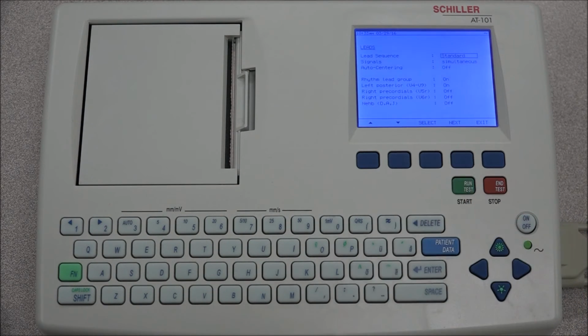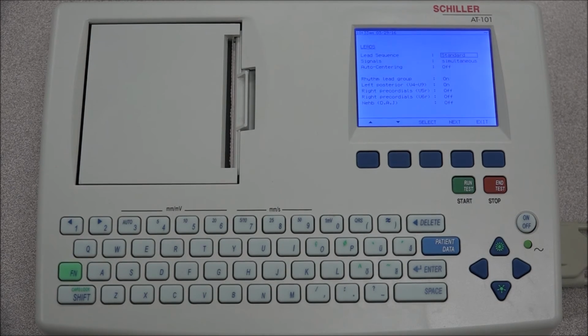Under the Leads tab, the lead sequence can be selected, as well as defining the type of signal. The auto-centering can be turned on or off, as well as the rhythm lead group. Under General, the auto storage can be set to automatic, manual, or off. This means that once a recording has been made, it will automatically be stored if set to automatic, and the automatic printout can be turned on or off as well as the automatic transmission.